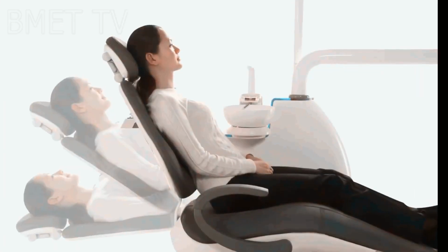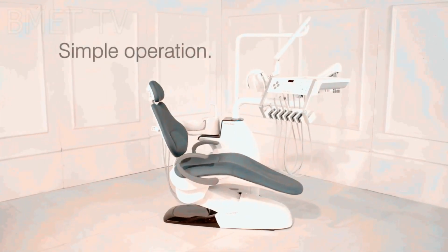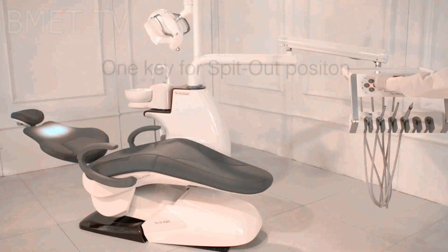All attachments, as the name suggests, are built into the ceiling and the chair is situated beneath these attachments. Dental chair-mounted design. Unlike the ceiling-mounted dental chair where attachments are built into the ceiling, a dental chair with a mounted design has the dental engine and attachments built into the actual dental chair.